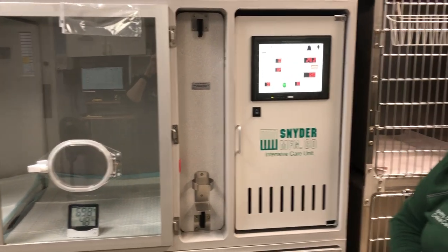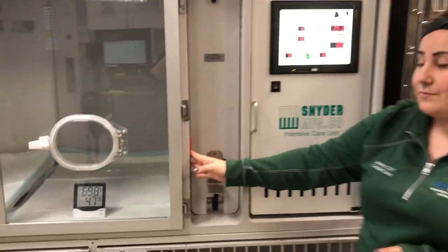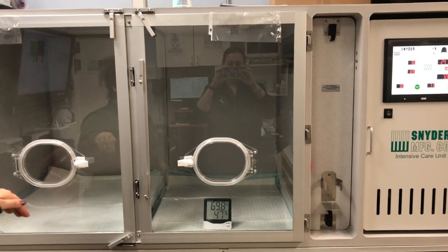The unit has several ports to run IV lines through — there is one here, and two that come down through the top. These should always stay plugged with a red cap if nothing is going through them.